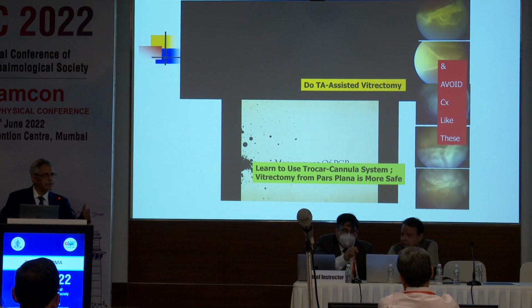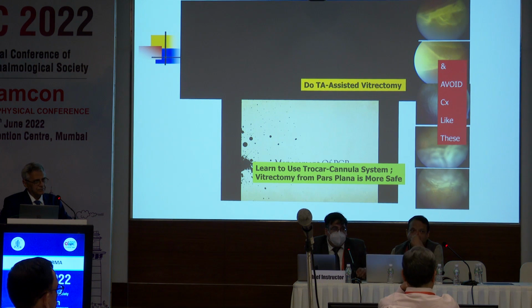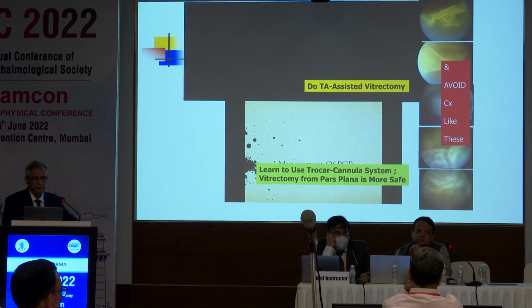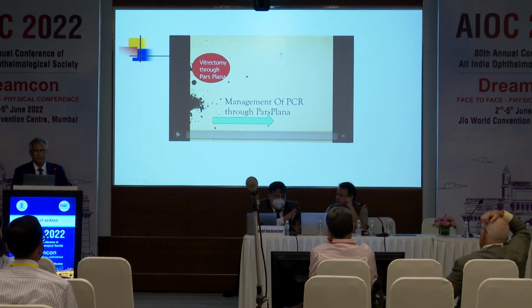So the other thing Dinesh was reacting to was that you can't put a phaco probe from there, even though all these phaco machines have a component of anterior vitrectomy, because that will not cut the vitreous properly. Not the phaco, but we put the vitrector. But what I'm saying is, if you have cortical material or even nucleus that's up front, have your rate slow, like 500. Then when you're going for vitreous, you go to 1,000, 2,000.